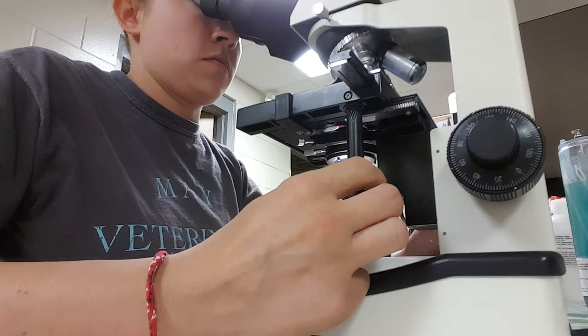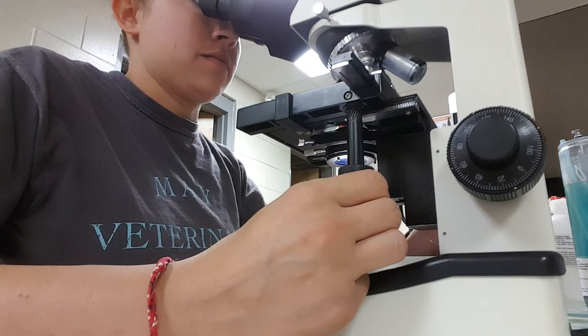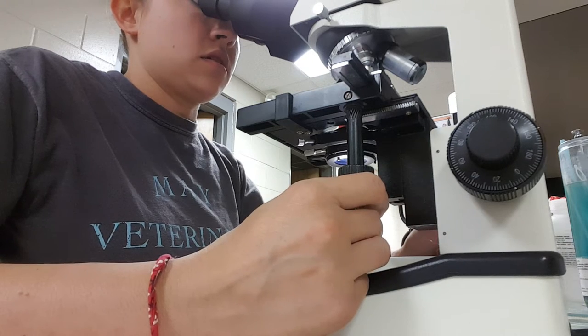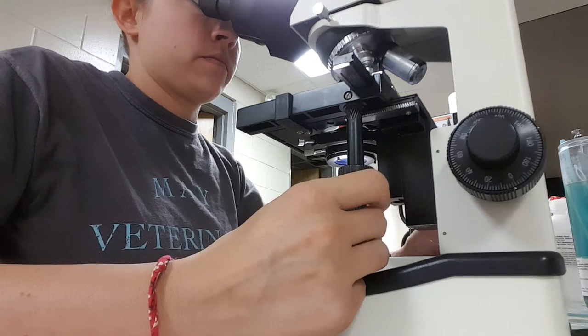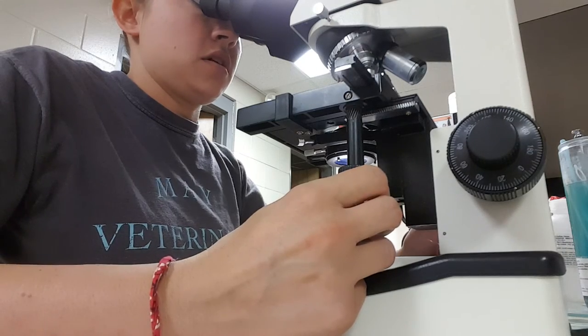And I'm just looking for movement. If you've ever seen the microfilaria before, sometimes they're very easy to see, and sometimes they're barely moving, so you have to really focus and take your time.